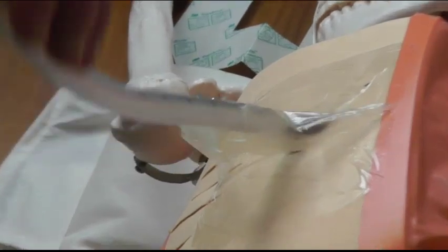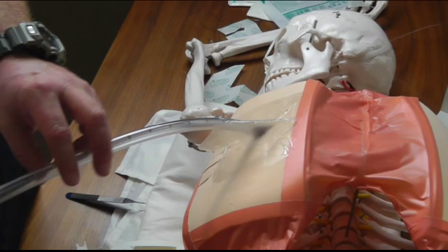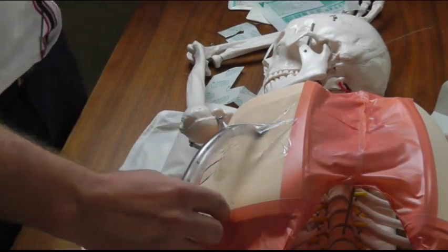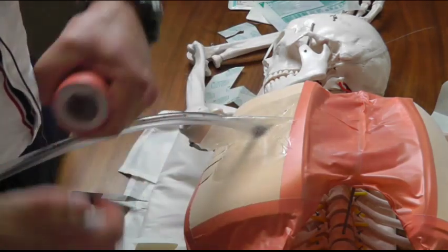Lastly, so you can see there actually, so that's the tube nicely in place. The last thing you want to do then is secure the tube to the patient and for that we're going to use my favourite thing in the world, sleek.